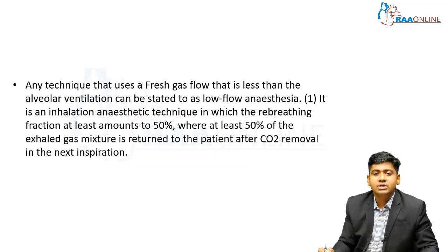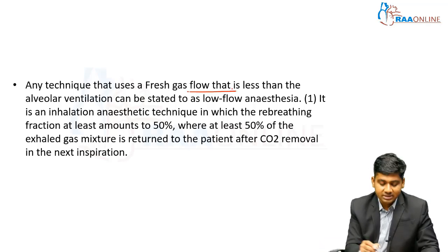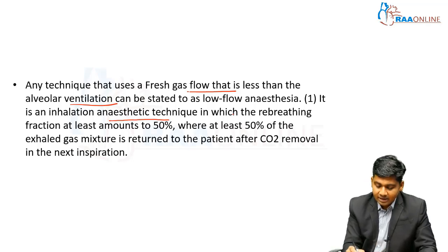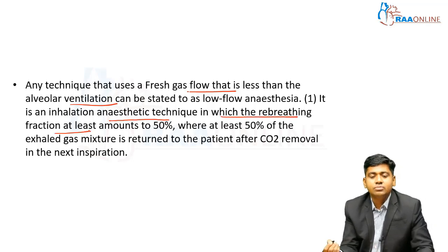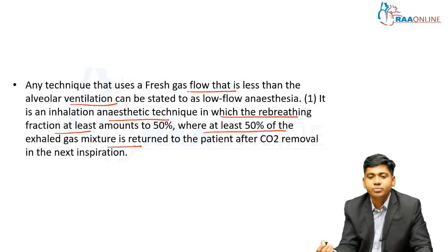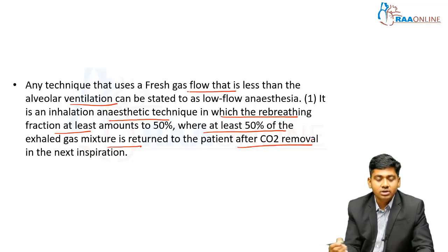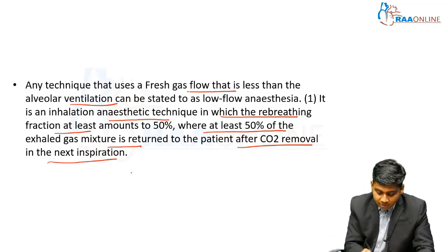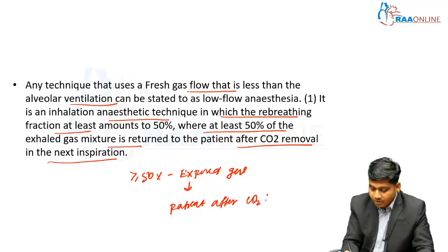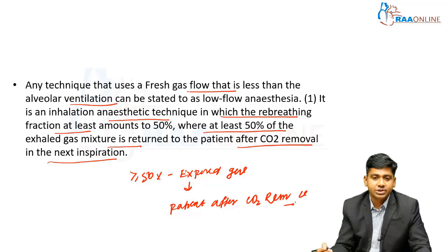Any technique that uses a fresh gas flow that is less than the alveolar ventilation can be stated as a low flow anesthesia. It is an inhalational anesthetic technique in which the rebreathing fraction is at least 50%, where at least 50% of the exhaled gas mixture is returned to the patient after proper CO2 removal in the next inspiration. If more than 50% of the expired gas is given to the patient after CO2 removal, it is known as low flow anesthesia.